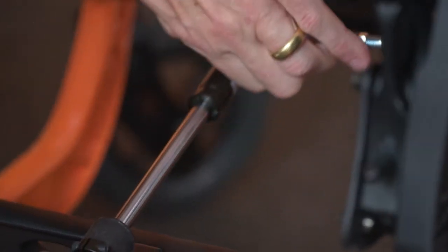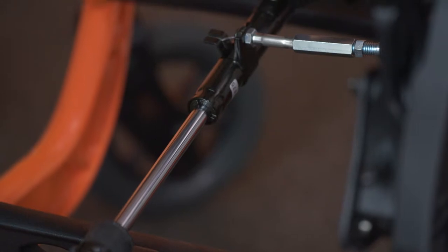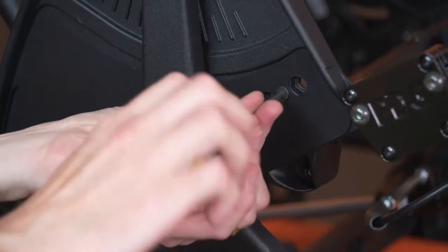With the tilt trigger removed, it is necessary to squeeze the activation lever of the MEC-LOK directly. Remove the cover plate fasteners and cover plate.